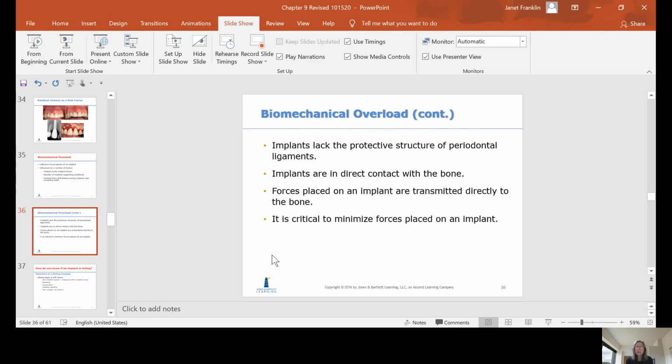an implant. So sometimes some doctors even will place an implant on somebody who has what we call a hard occlusion, or they bite really hard, their teeth together. They will actually take the implant down a little bit lower than the surrounding teeth so that the surrounding teeth contact first before the food gets onto the implant and causes force, in order to keep the occlusal force lighter on an implant. Those are all decisions that are made by the doctor.